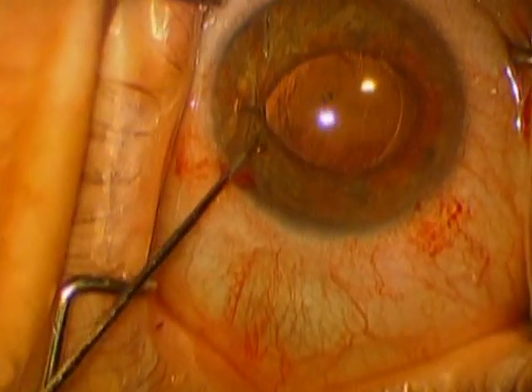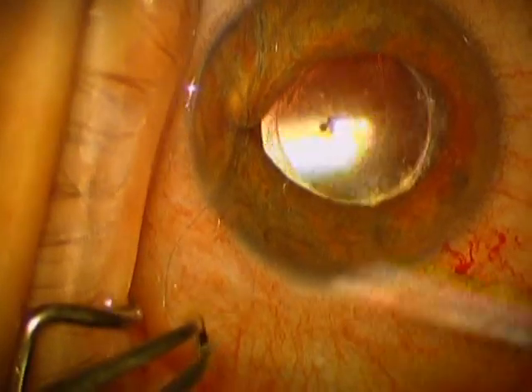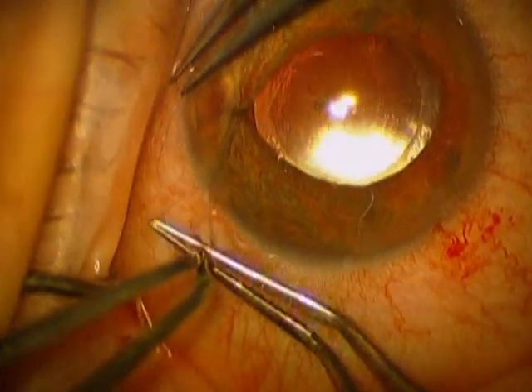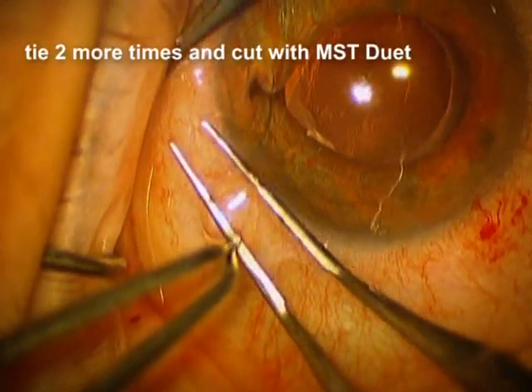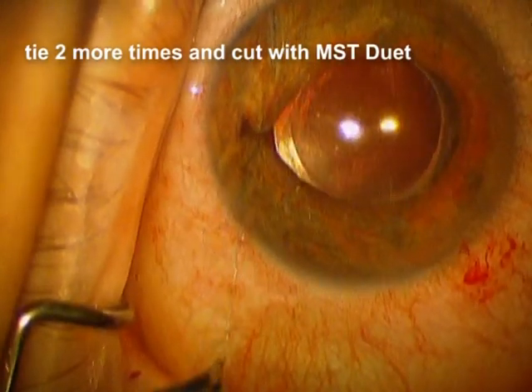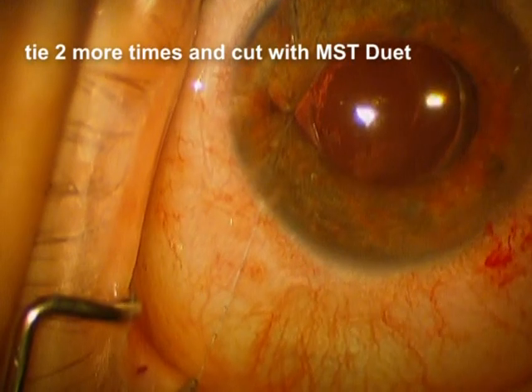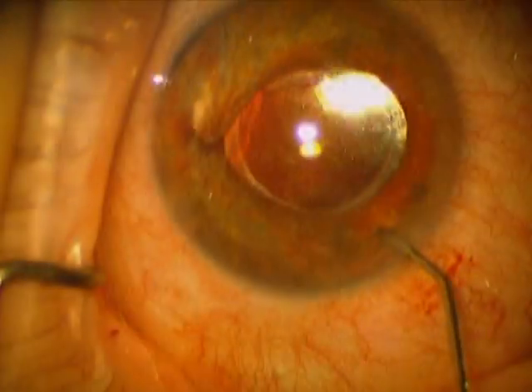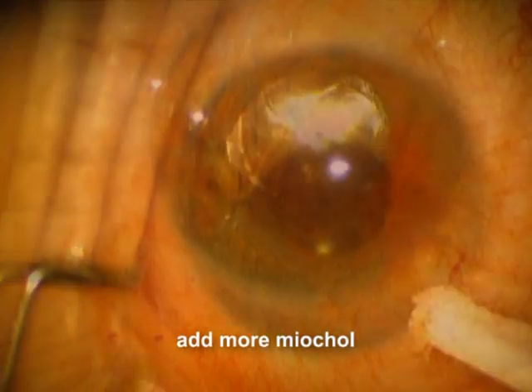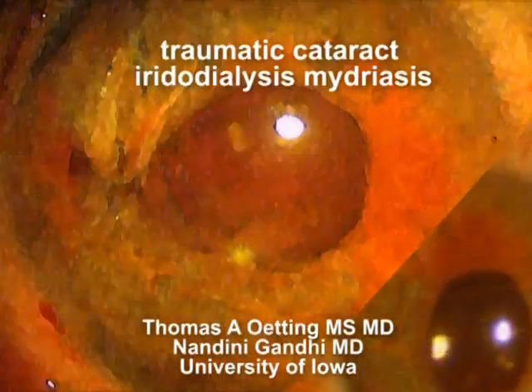And we're going to do this again two more times. I usually go three times and then two and then two — that's usually plenty good. Here's the second time we go, and you can see at a little bit better magnification: pulling it through the loop and then pulling the two free ends, and the knot goes inside the eye. Then you cut off the ends of that knot with Duet scissors. We're going to add some more Miochol here. You can see how the pupil comes down fairly nicely and the patient was pretty pleased with the cosmetic appearance, and she had less glare.